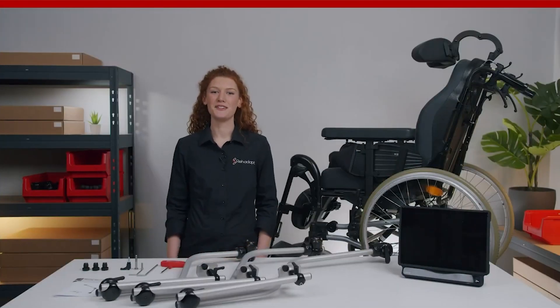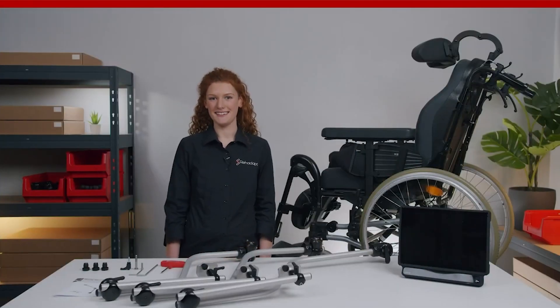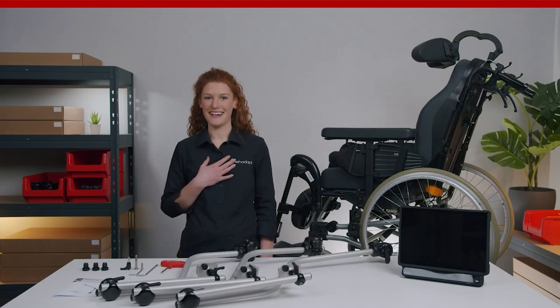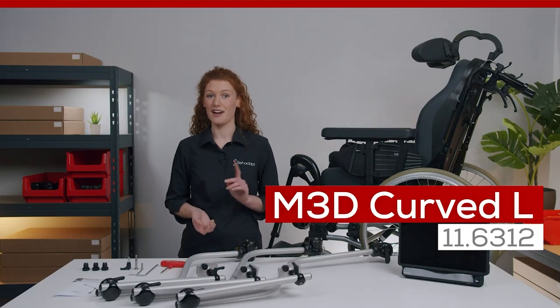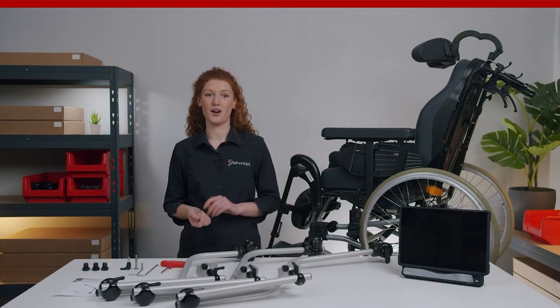Hi guys! Welcome to a new episode of Monty Made Easy. I'm Nadine from Rayadapt. In today's episode I want to introduce you to a wheelchair mount idea for eye gaze devices. It is the Monty 3D curved L mount and I will also show you how to assemble it on a wheelchair.